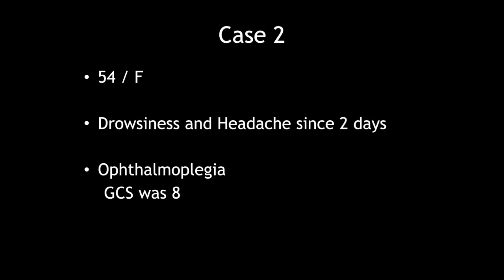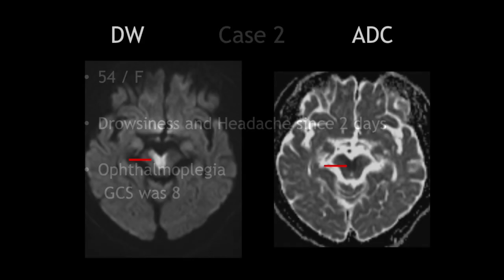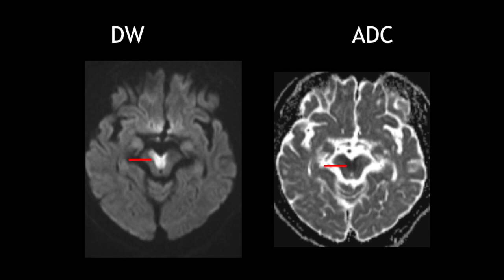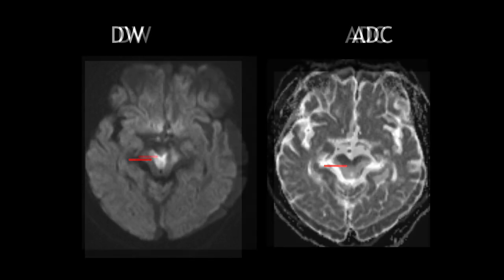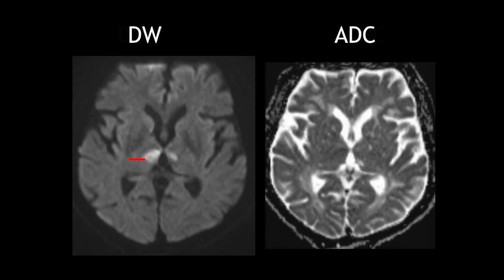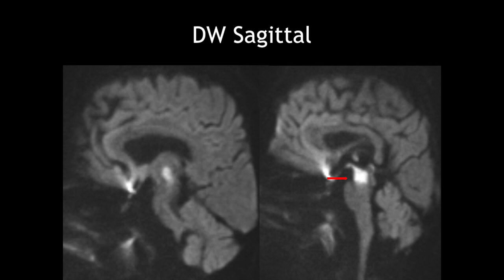This was a 54-year-old female who came with drowsiness and headache since two days. On examination she had ophthalmoplegia and her GCS was 8. MRI of the brain showed restricted diffusion in the rostral midbrain as well as in bilateral paramedian thalami, appearing bright on diffusion-weighted images and dark on corresponding ADC maps. Sagittal diffusion-weighted images confirmed restricted diffusion in the paramedian thalami and rostral midbrain.